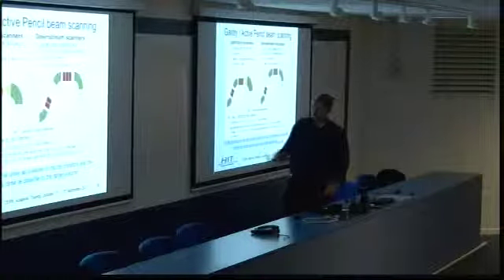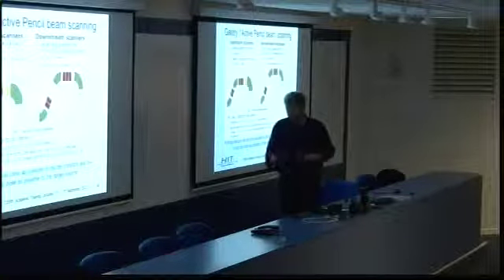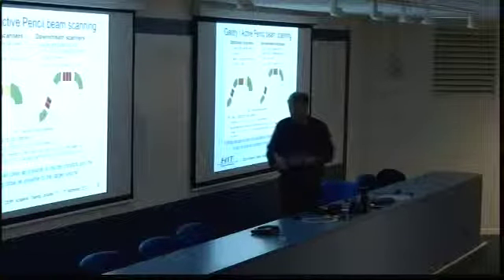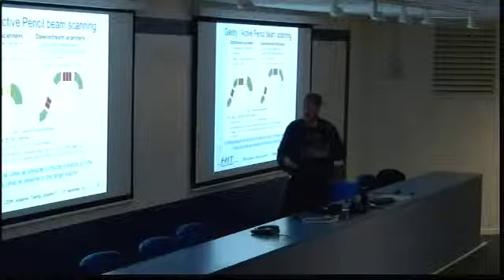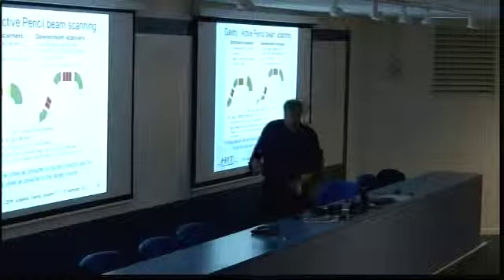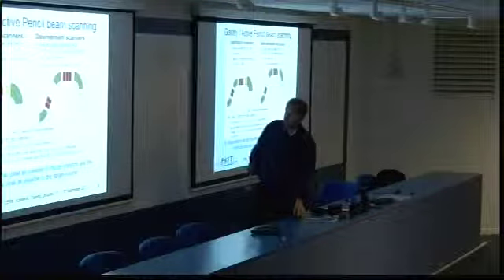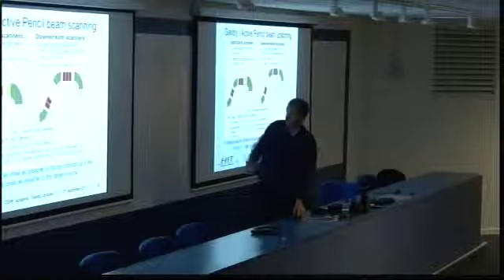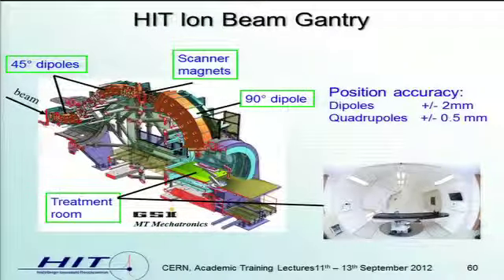At the end, you have to bring the vacuum as close as possible to the nozzle because of the straggling, and the nozzle as close as possible to the patient, to the target volume, but nevertheless you have some safety rules so you are not free in any parameter. So it's a long process to develop all these right dimensions. And this is our solution for that.